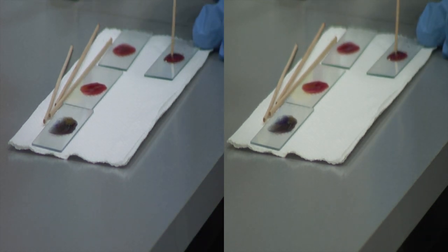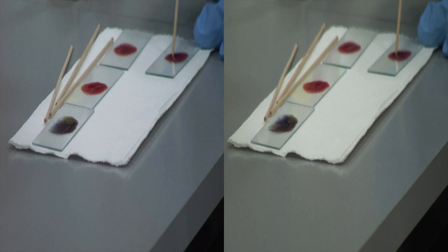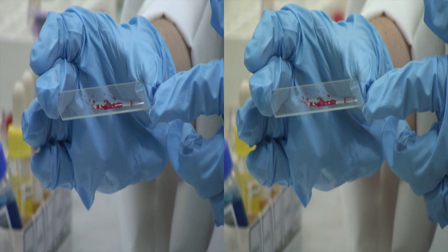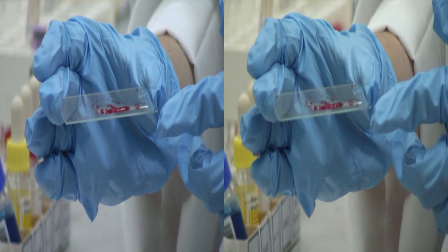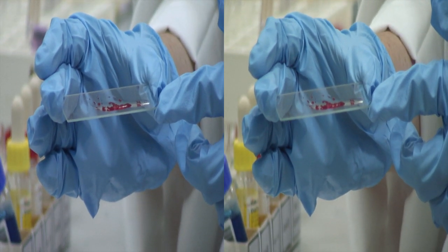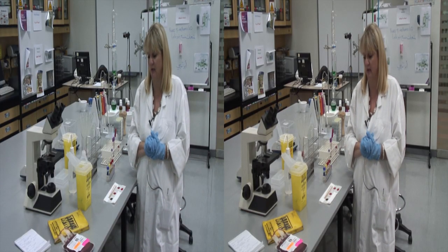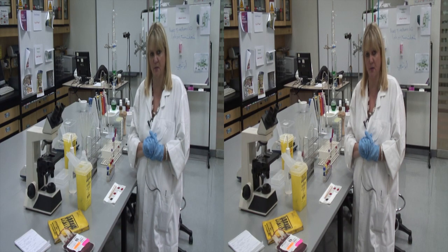Blood is mixed gently for around a minute using the orange stick to observe for agglutination. After around a minute, it is clear that there is agglutination with the anti-D. The final group of the donor can therefore now be called a group A RH positive.